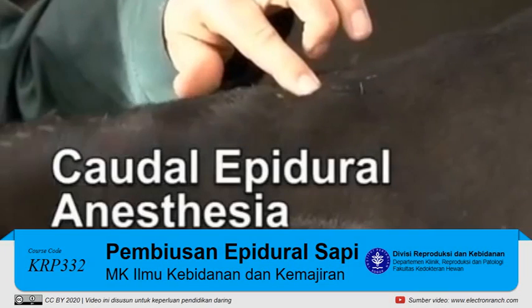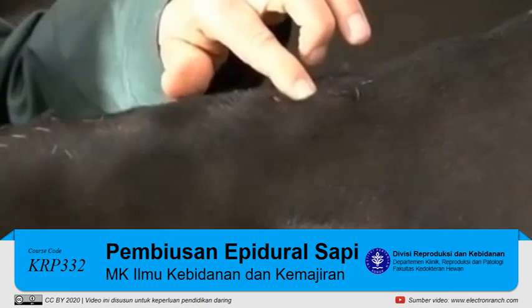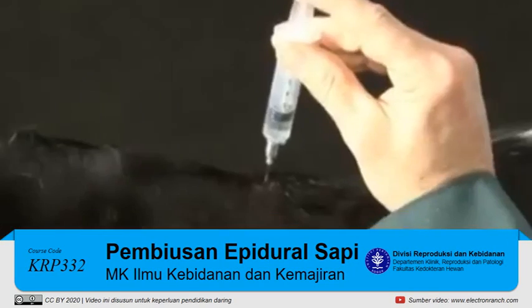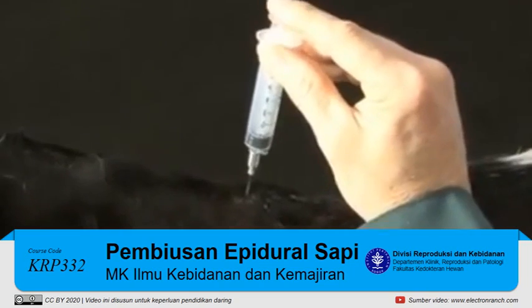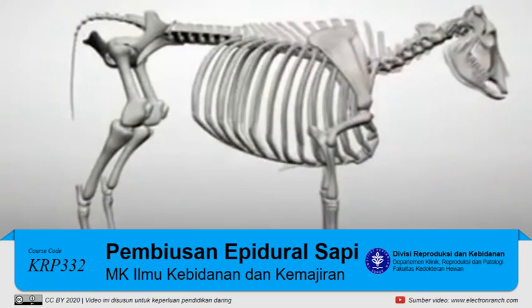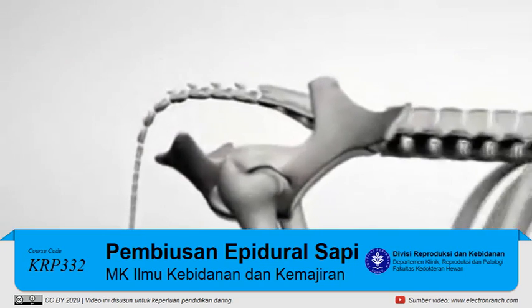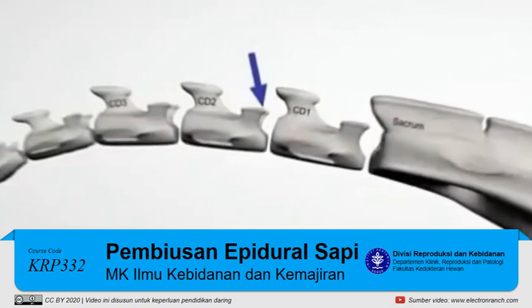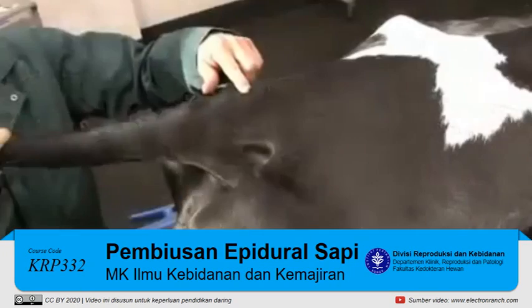Caudal epidural anesthesia can be performed on cattle to provide anesthesia to the caudal body regions for surgical procedures and to block straining and tenesmus. Epidurals are administered in the epidural space between the first and second caudal vertebrae.